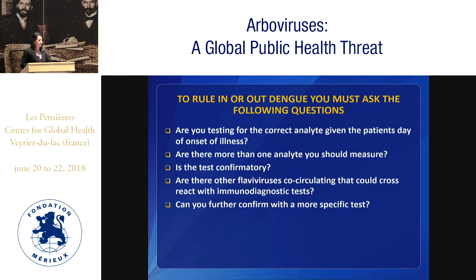To rule in or rule out dengue, you must ask yourself the following questions. The problem with dengue diagnostics nowadays is that people who try to do diagnostics have no understanding of the kinetics of all the virus, antigen, and antibody, so they're not really using the right test. So: are you testing the correct analyte given the patient's onset of illness? You see people testing for PCR at day 10, really wasting a lot of reagents. Are there more than one analyte you should measure? Is the test a confirmatory test? Are there other flaviviruses co-circulating that could cross-react if you're using an immunodiagnostic test? And can you further confirm your testing?